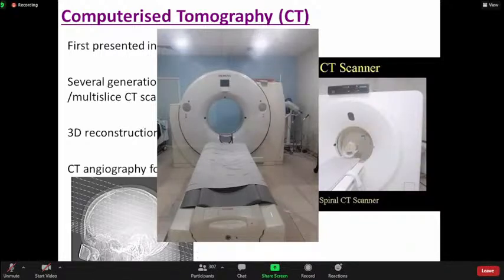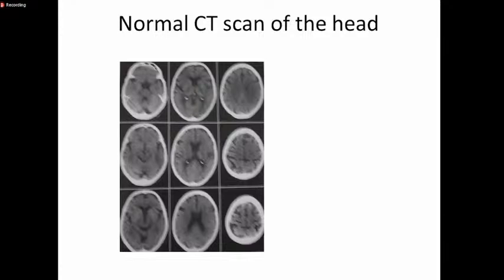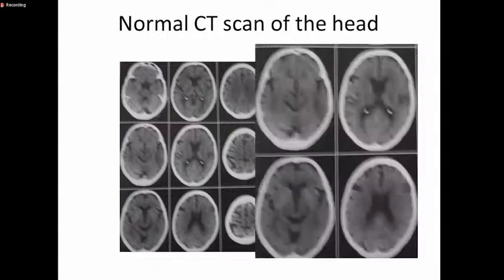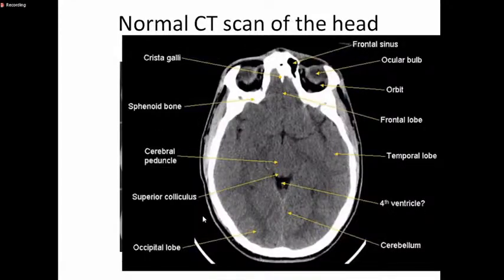Then you're left generating a very good modality where you are able to see quite a lot, able to see right inside, you can see bone detail. The CT also allows you to do what we call windowing, and you can use a window that depicts bone very well.